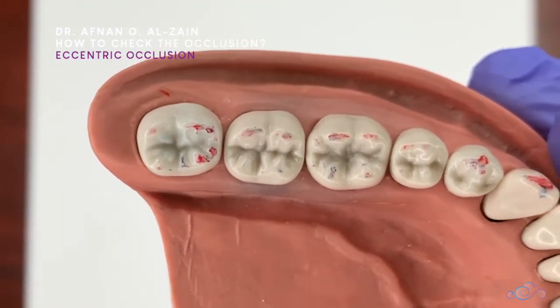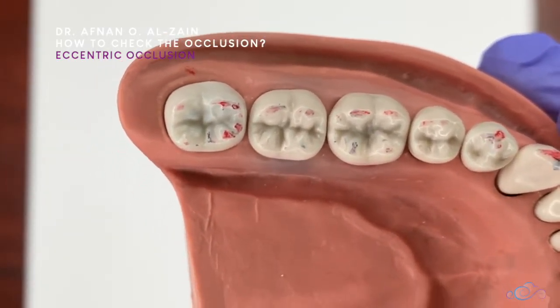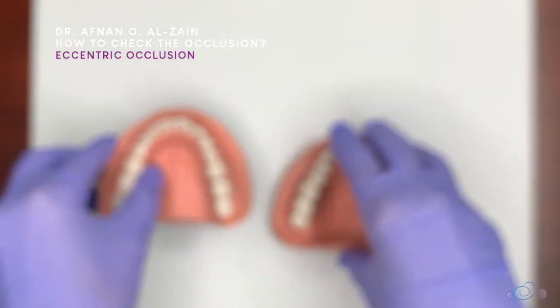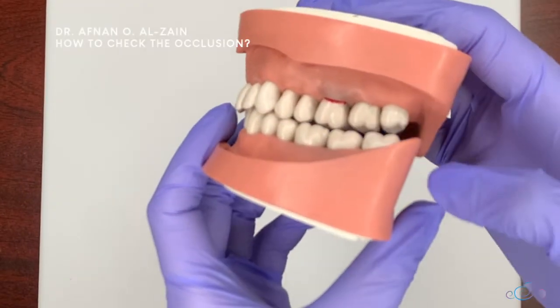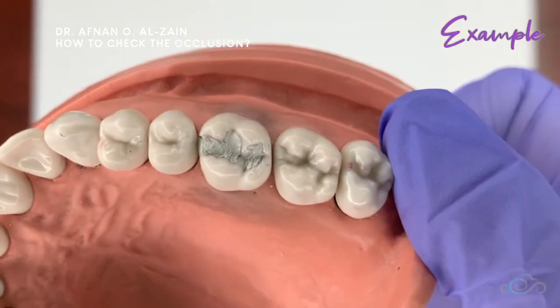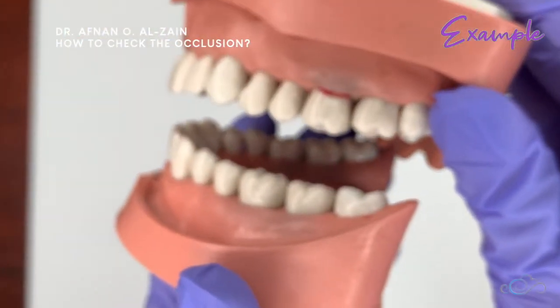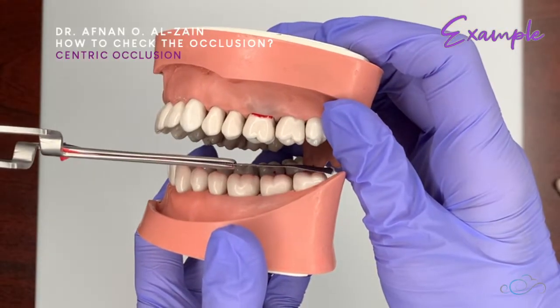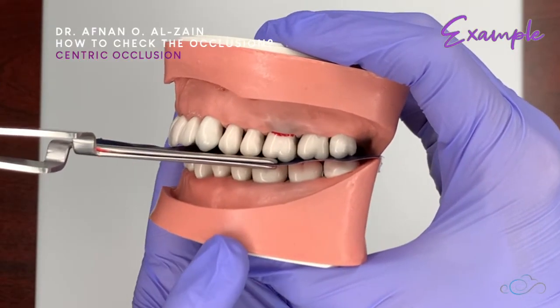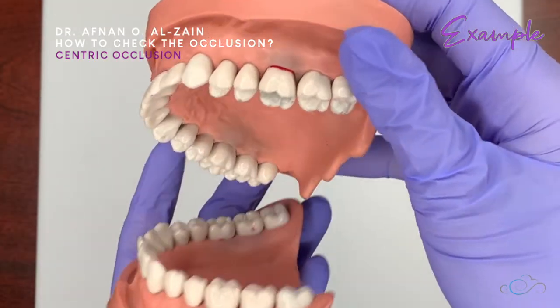It is better if the patient is sitting upright so they can feel it properly. Let us now see an example of a restored tooth — here we have an amalgam restoration and we're going to check occlusion for this tooth. First, dry the teeth, then place the articulating paper and ask the patient to bite for centric occlusion. Tug on the articulating paper, ask the patient to open, and check the markings.